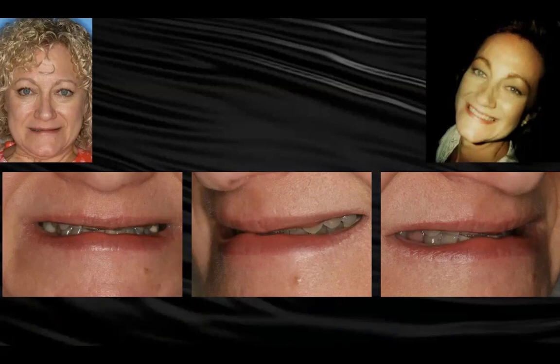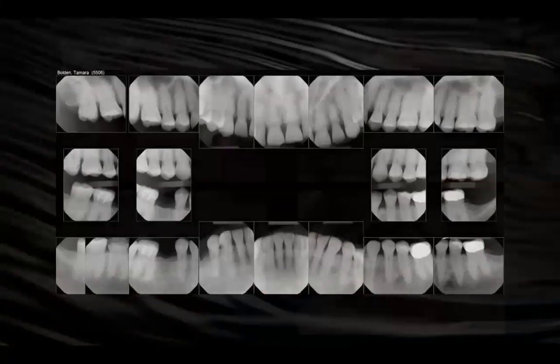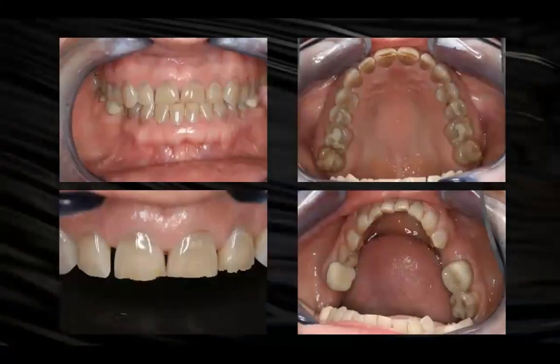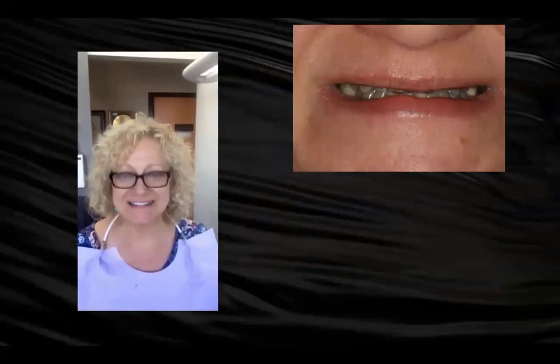She'd gone through ortho and orthodontic surgery, and things just didn't work out. Biomechanically, there was plenty of bone around the teeth, and the teeth were strong, but look at all the wear and tear she had. So in order to give her the smile that she deserved, I went ahead and waxed this up. And I don't use wax, I use composite. It's easier for me, and I create a matrix on this. And you can see here, she's seeing how beautiful her smile is.